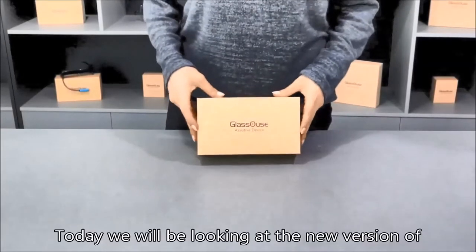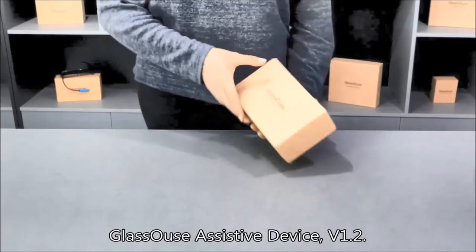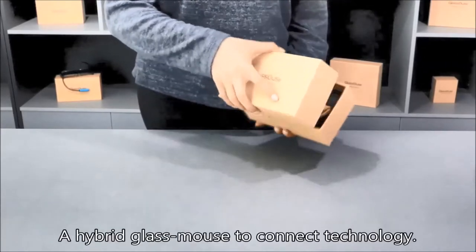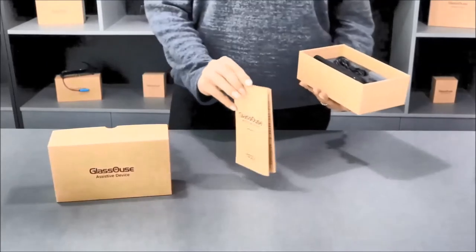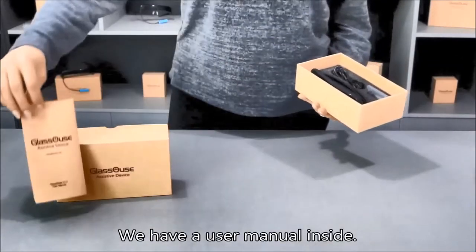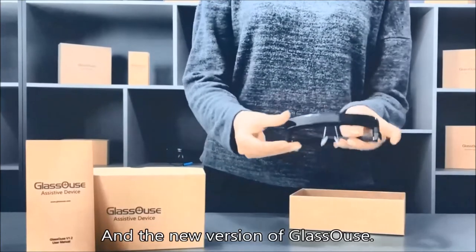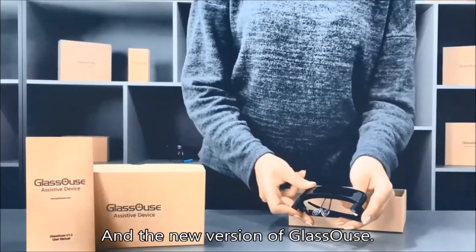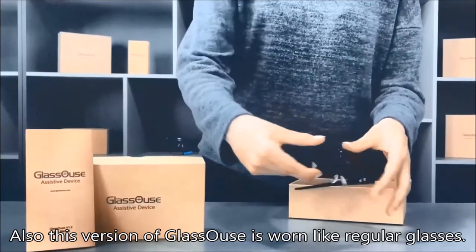Hello everyone. Today we will be looking at the new version of GlassOuse Assistive Device version 1.2, a hybrid glass mouse to connect technology. We have a user manual and a new version of GlassOuse. This version of GlassOuse is worn like regular glasses.